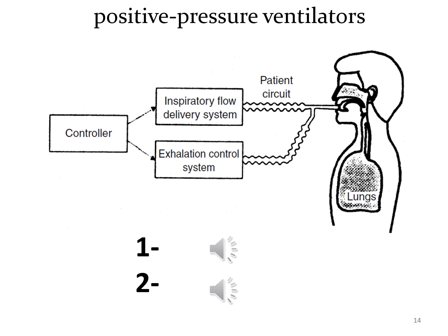When the ventilator switches to exhalation, the inspiratory flow delivery system stops the positive pressure and the exhalation system opens the valve to allow the patient's exhaled breath to flow to the atmosphere.